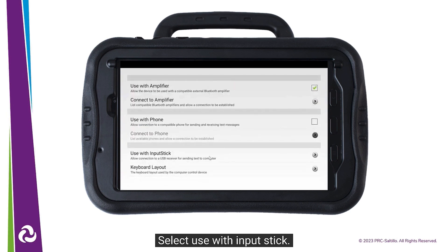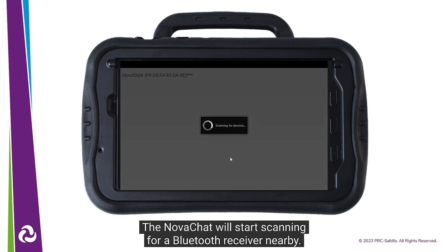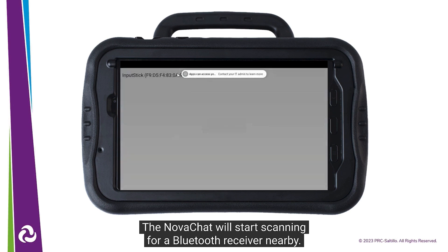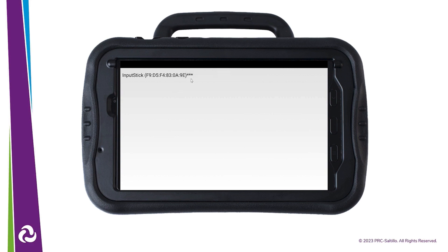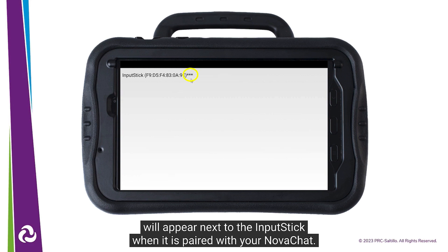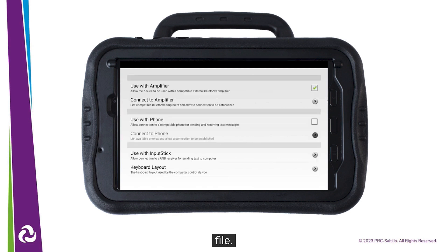Select Use with Input Stick. The NovaChat will start scanning for a Bluetooth receiver nearby. When you see the input stick in the list, tap on it. Three asterisks will appear next to the input stick when it is paired with your NovaChat. Use your back arrow to get back to your vocabulary file.